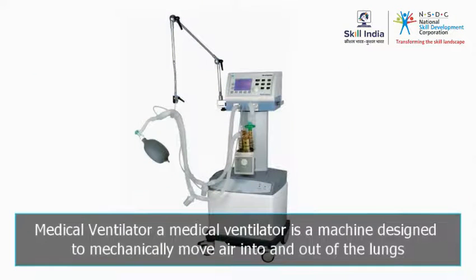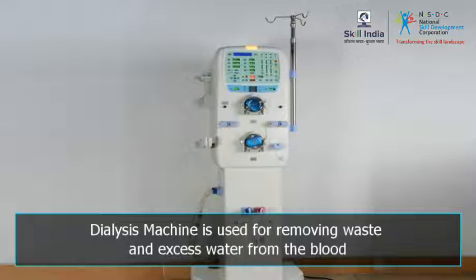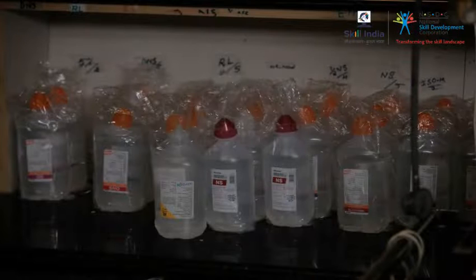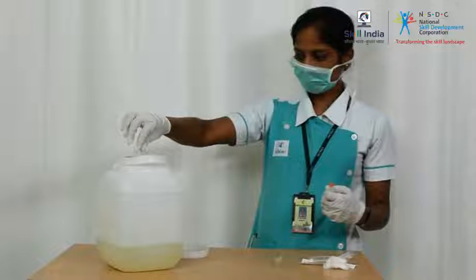A medical ventilator is a machine designed to mechanically move air into and out of the lungs. It helps a patient who cannot breathe on his own. Dialysis machine is used for removing waste and excess water from the blood. It is used as an artificial replacement for a kidney that has failed. In addition to the medical equipment, there are specialized equipment such as saline bottles and equipment used in the feeding and medication of the patient.